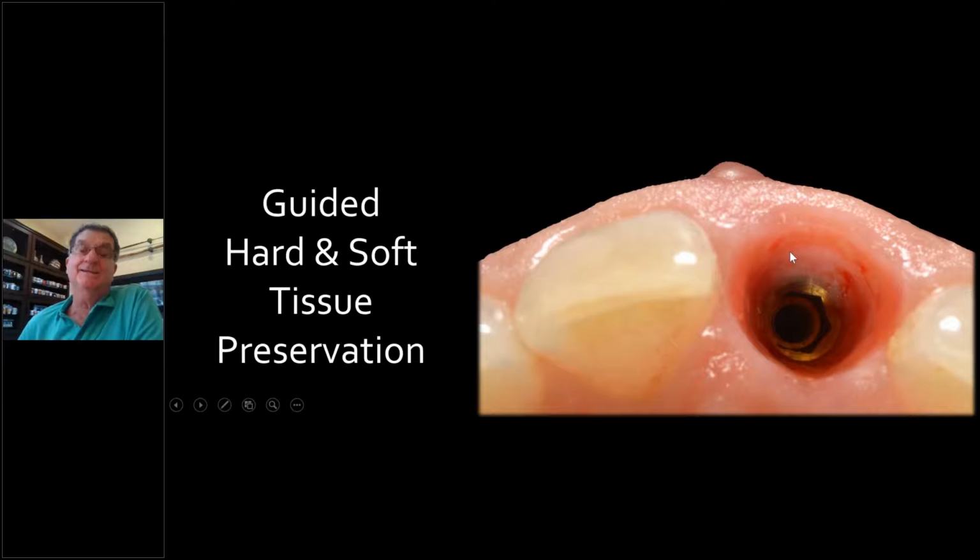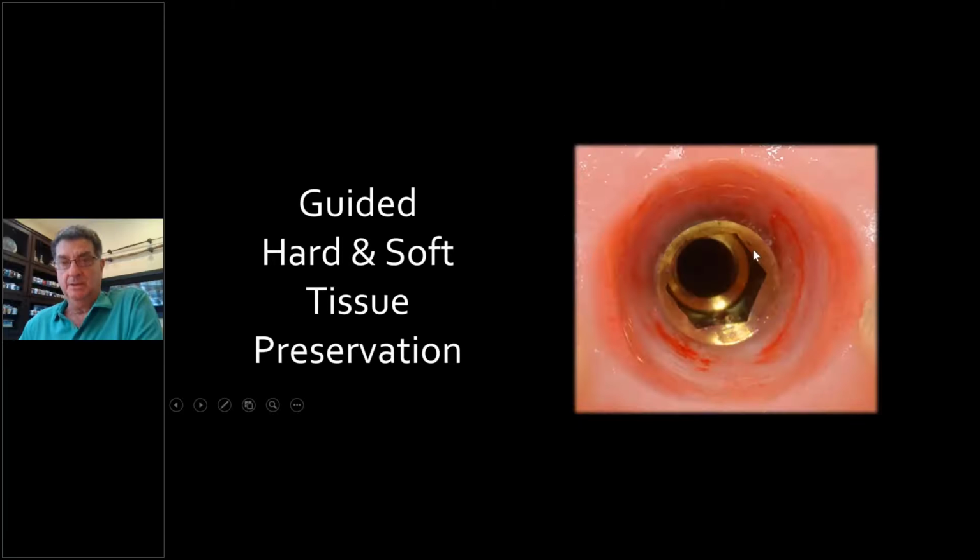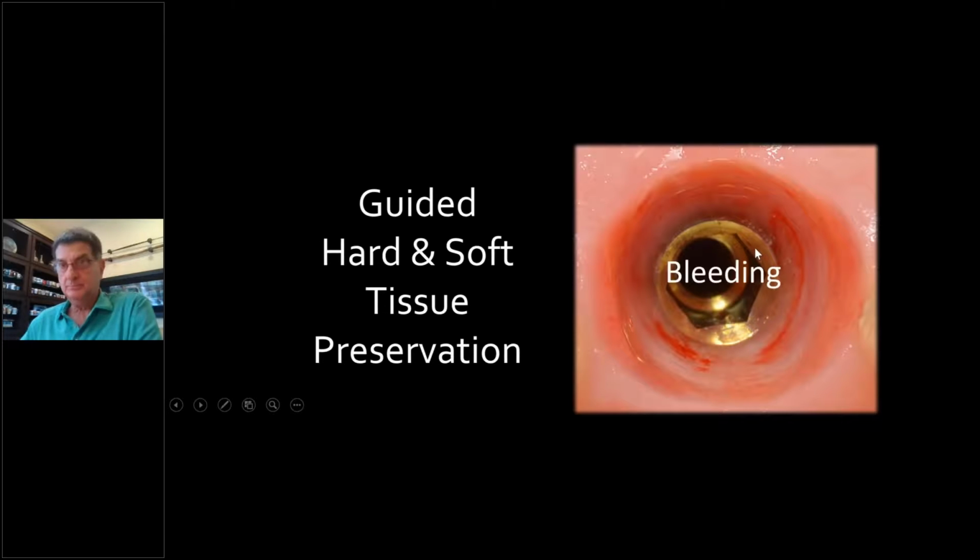Epithelium can adhere to any clean surface. It can adhere to titanium. It can adhere to ceramic. It can adhere to acrylic. And so when you have a fresh piece of acrylic in here, you actually get this bleeding. It's really the junctional epithelium on the temporary, and it allows this beautiful tissue to heal. Look at the thickness. So this is what it looks like. The bleeding is actually good the first time you take it off.